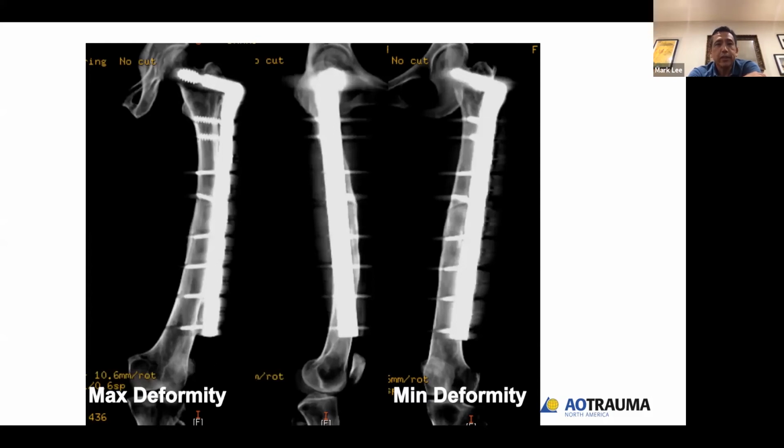And for sure, I just think it's critical for the rotational analysis and understanding that. I do hear, and I've heard in this course in other places, that you don't necessarily need the continuous CT top to bottom. But I will say that when I'm dealing with a patient who has bad bone or suboptimal bone, and I'm thinking about an intramedullary solution, I frequently do actually use the CT.